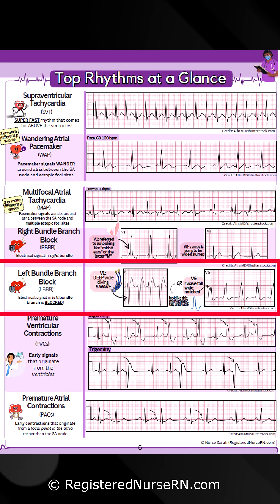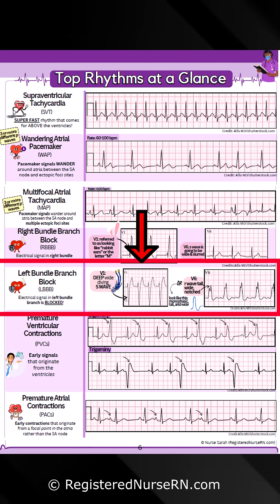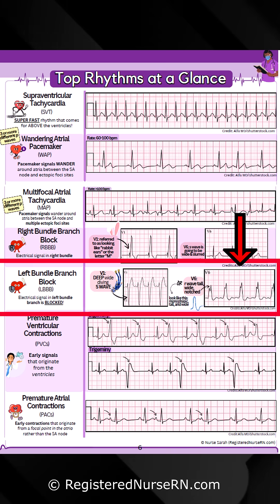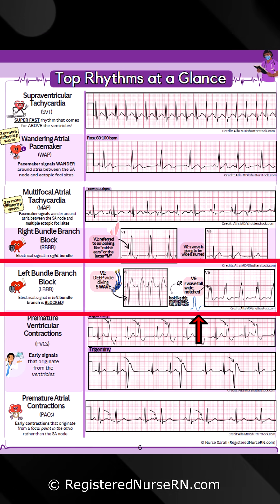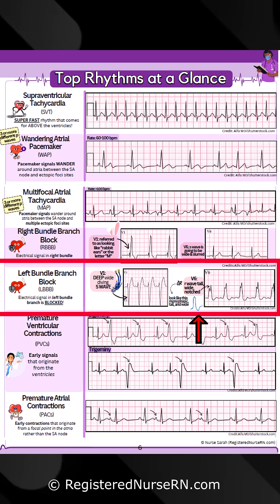Left bundle branch block is where electrical signals in the left bundle branch are blocked. In V1, you'll have a deep diving S wave like this example. And in V6, the R wave can be tall, wide, and notched like this — or it could look monophasic, tall, and wide.